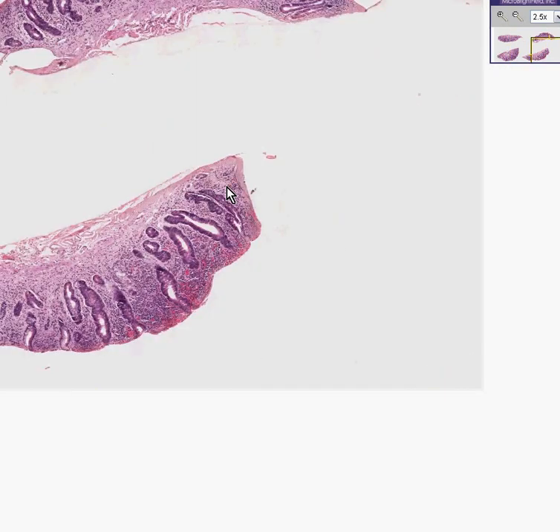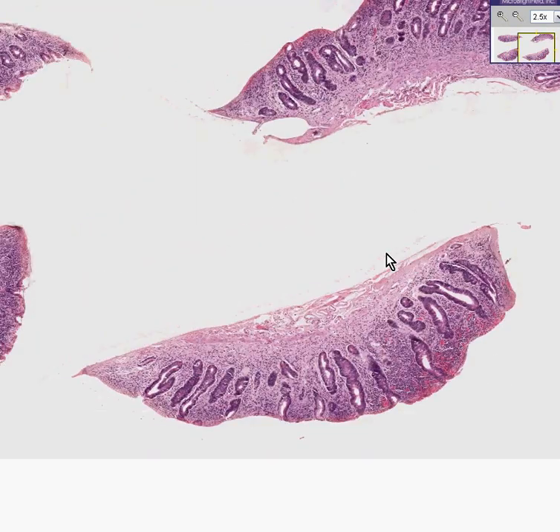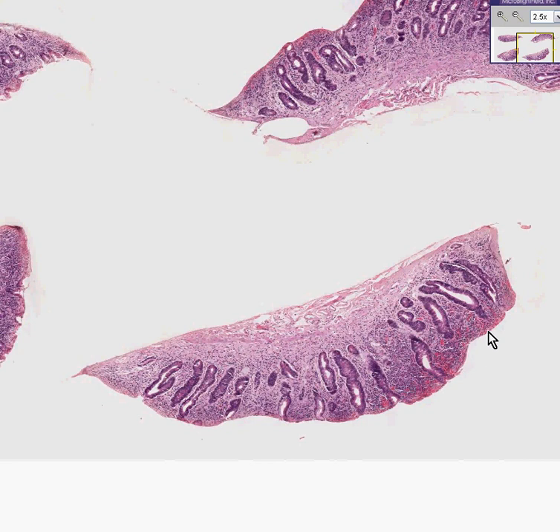I can reassure you once again, this is small bowel, but the villi are gone. They are flattened. They are atrophic. You still have some glandular structures traveling internally within the mucosa, and you certainly have a good amount of chronic inflammation, but the villi are gone.